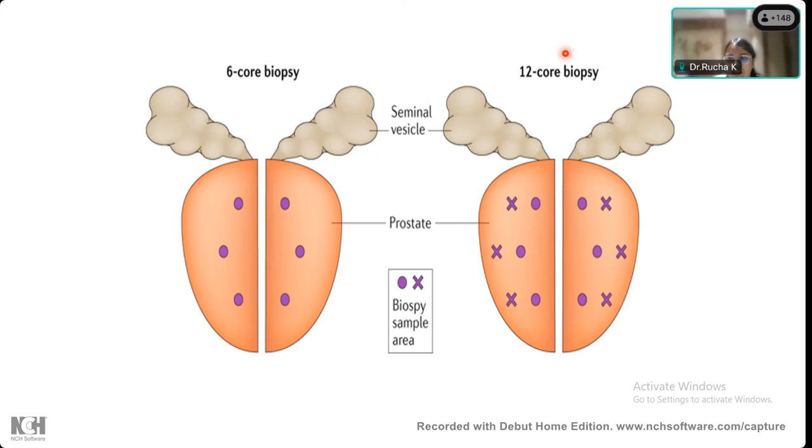So, sir, I think in prostate, the diagnosis is given based on the cores, like the patterns can be different in each core. Right? So, supposing this was a breast tissue, you would put in one needle at one point. Does anybody know? Srinivas, can you tell me? Sir, usually based on Gleason's types, there are 6 types. So which type is more prominent? From that, we'll view the higher diagnosis. Okay, that's one of the points.